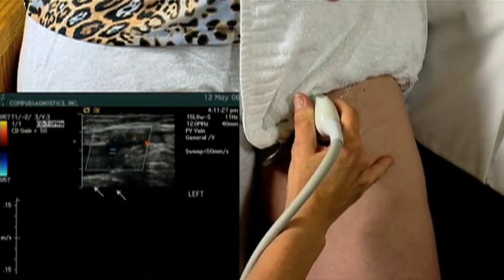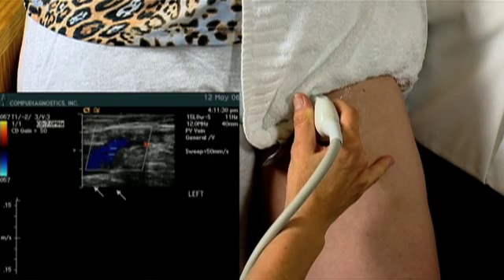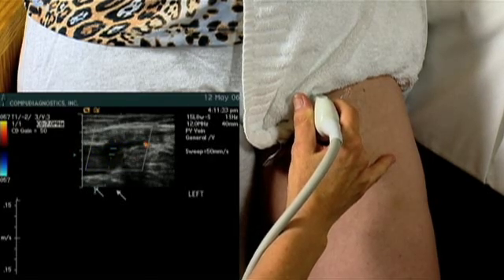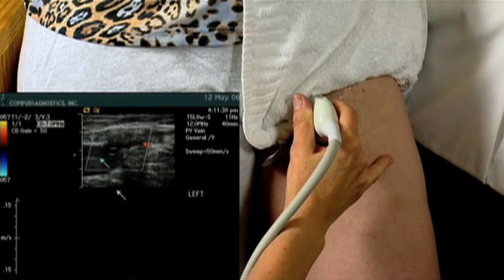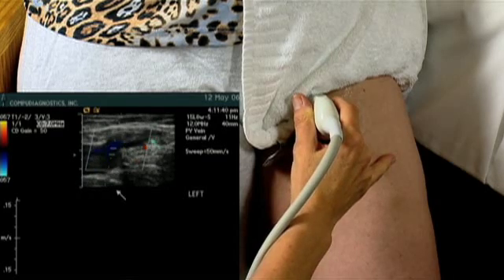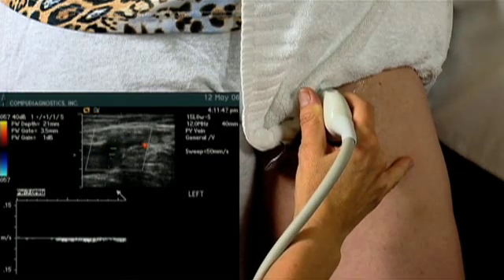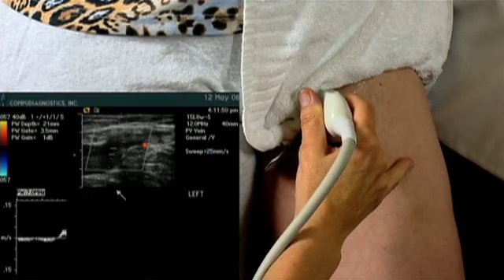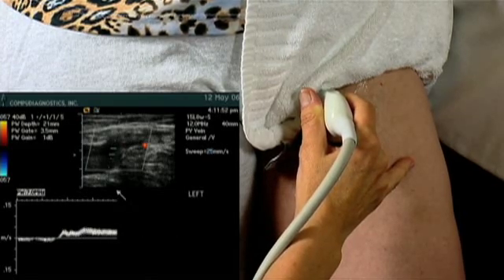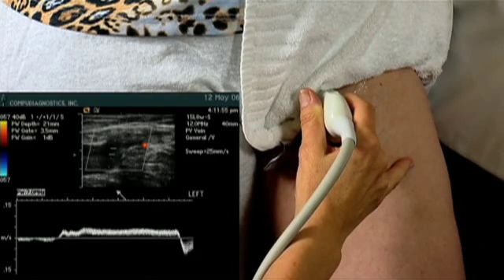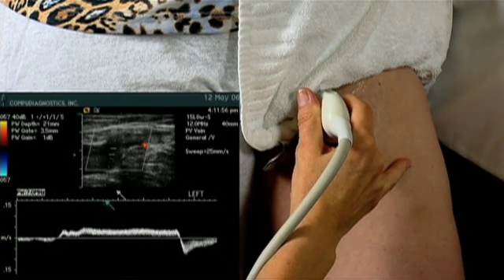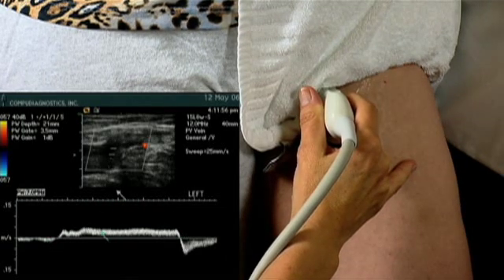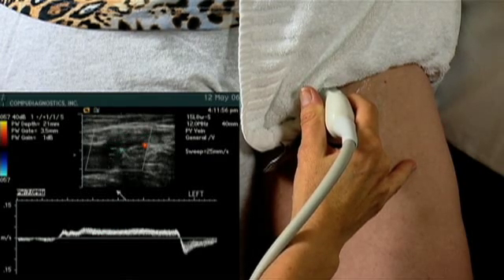We'll have the patient perform a Valsalva. We're going to adjust our focal zone and enlarge our gate. And bear down — breathe, please. This is a nice demonstration of one, two, three, four seconds of retrograde flow at the terminal valve, demonstrating terminal valve incompetence.